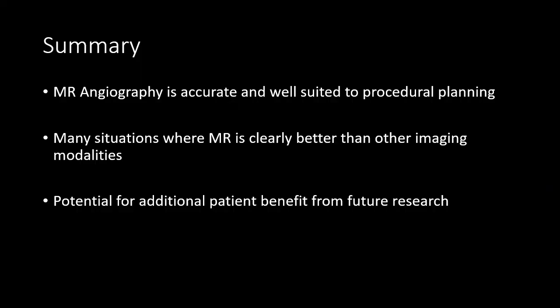So in summary, MR angiography is very accurate and it's well suited to procedural planning for interventional radiology. There are many situations where MR is clearly better than other imaging modalities, and there's potential for additional patient benefit from future research.